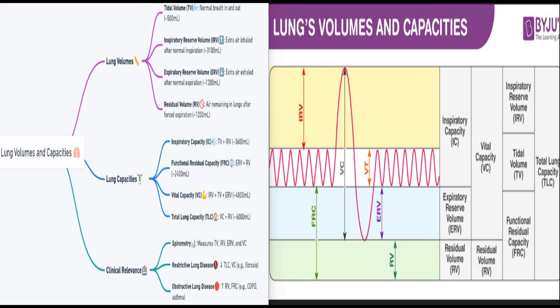With the flow volume loop, the x-axis has to do with the volume. The total lung capacity and the residual volume are shown, and the volume between the total lung capacity and the residual volume is what we're seeing. The y-axis basically has to do with the flow. So that's why it's the flow volume loop, and the peak expiratory flow is indicated over there on the y-axis, and the peak inspiratory flow is also indicated in this loop.